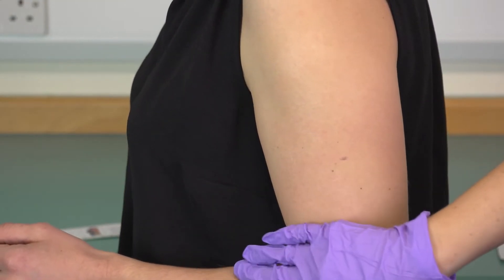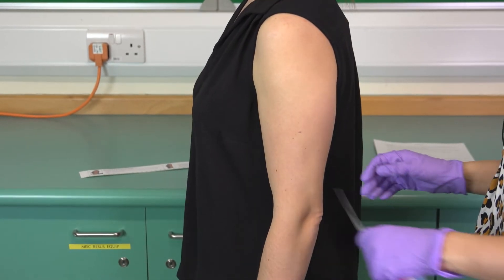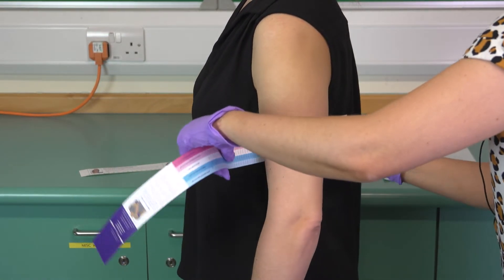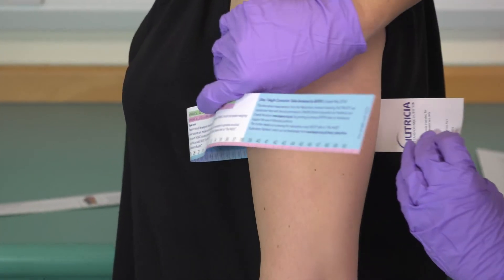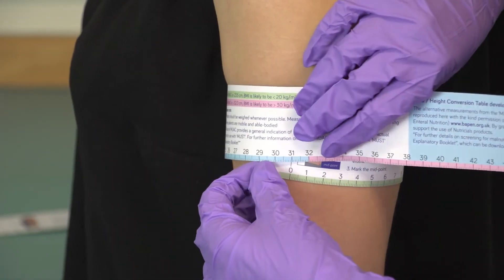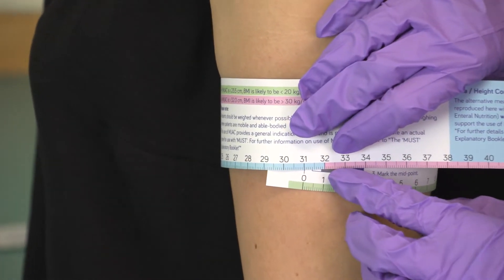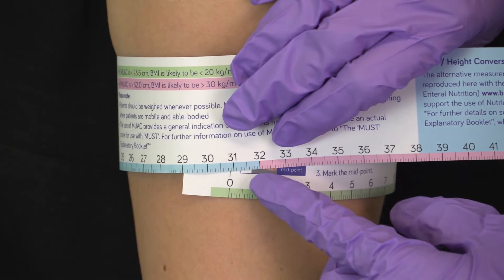When taking the arm circumference measurement, the arm should be hanging down by the side of the body and relaxed. Put the tape measure around the midpoint and record the measurement. The tape should not be too tight to pinch the skin or too loose, and the zero mark should line up with your measurement.